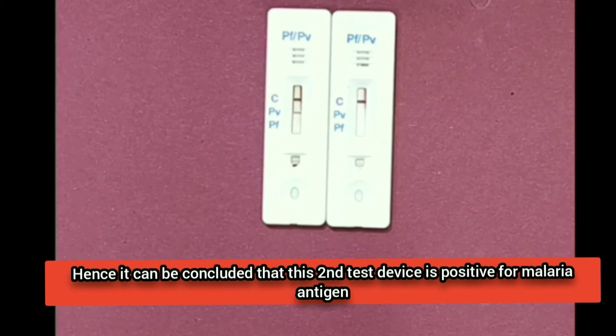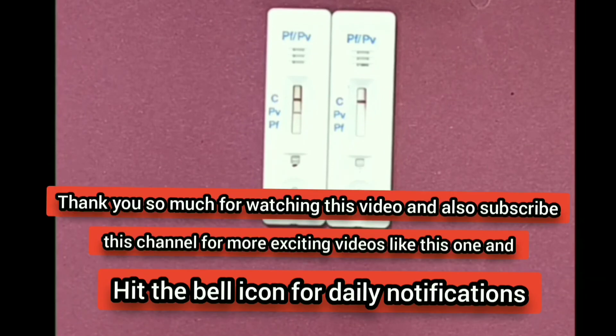It can be concluded that this test is positive for malaria antigen. Thank you so much for watching this video.